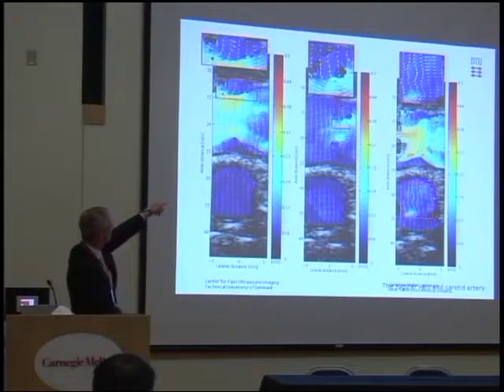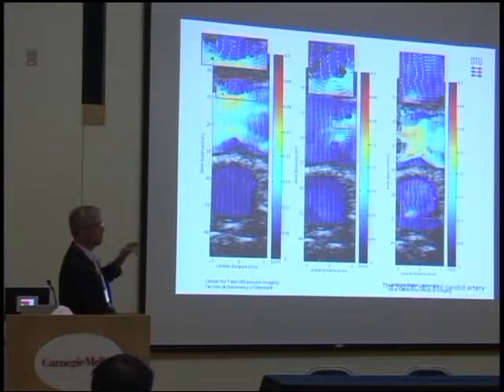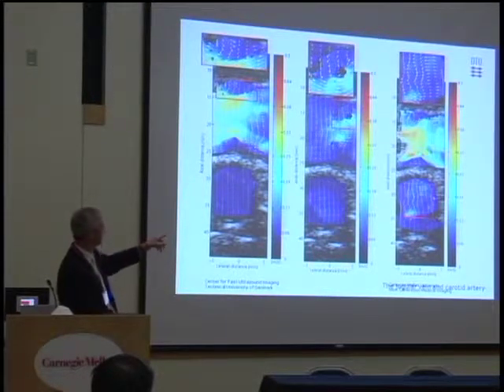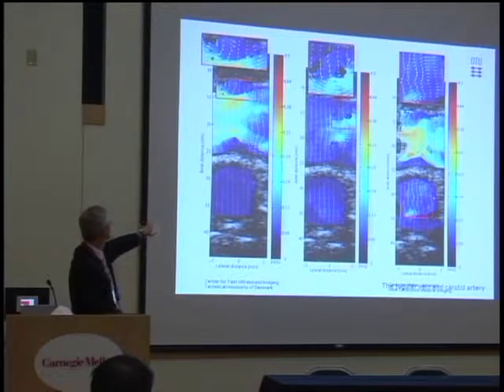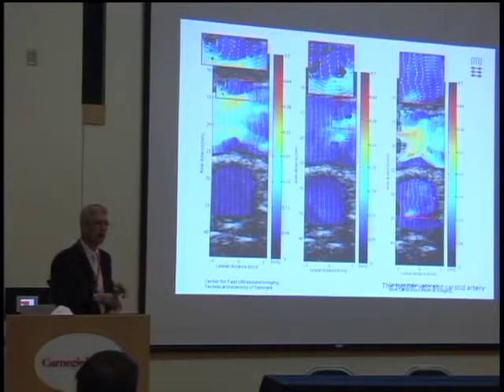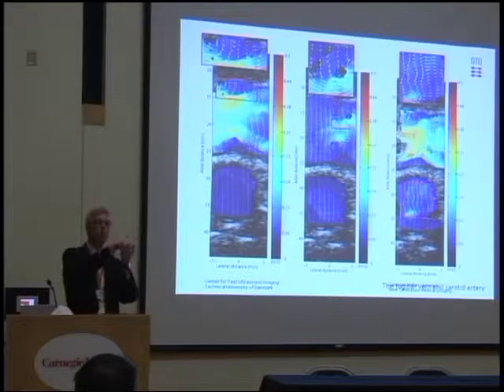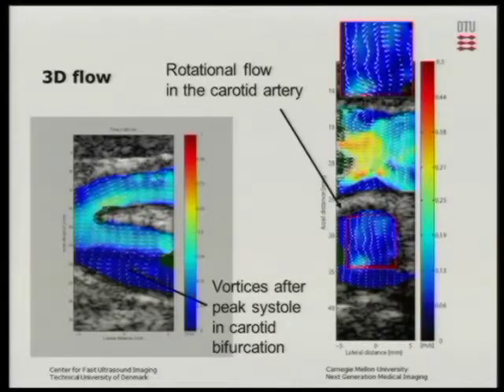And that's when you see the flow vectors going in the other direction and the vortex changing sign, so it's going counterclockwise. So of course you can start seeing: does the valve work or not? One interesting by-effect we saw in the carotid artery is that here you see the flow going directly out, but you can also see there's a rotation. It also rotates around, so it makes a vortex in this direction, but it also rotates around in this direction. So when we look at it, we have motions in two different planes.